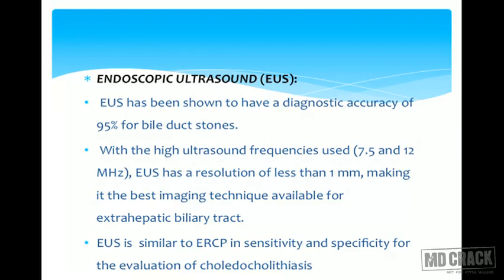Nowadays, EUS, that is endoscopic ultrasound, has also come. EUS has been shown to have a diagnostic accuracy of 95% for bile duct stones. With the high ultrasound frequencies used, like 7.5 and 12 MHz, the EUS has a resolution of less than 1 mm, making it the best imaging technique available for the extrahepatic biliary duct.